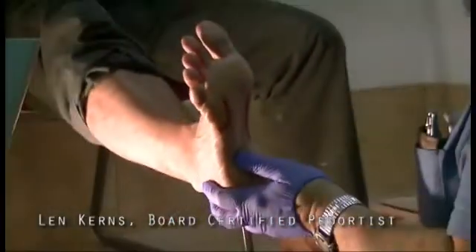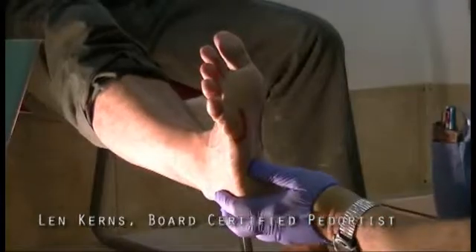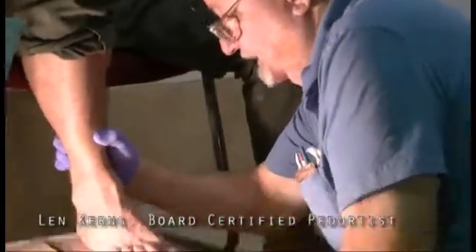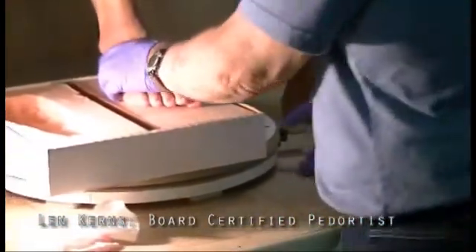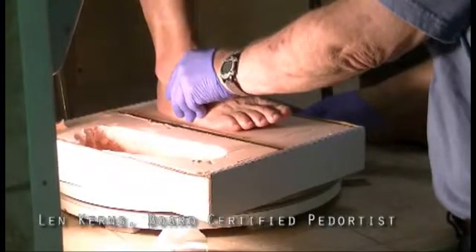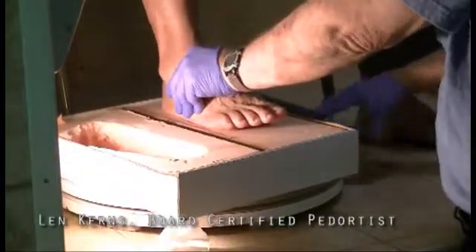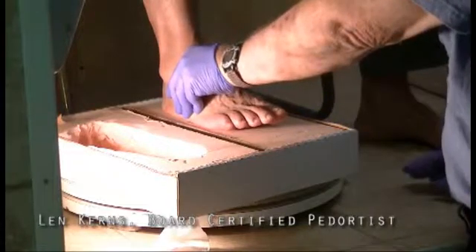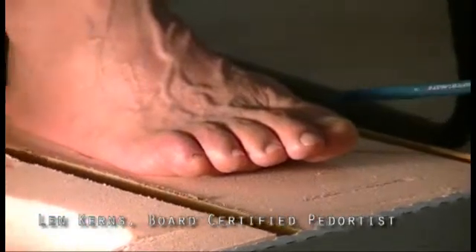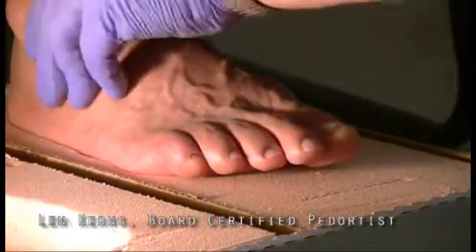And if you want to show me that the tendon is, you want a groove for the tendon, you place the foot again at 90 degrees on the box of foam. Turn it clockwise, counterclockwise. You see it's pronating. Now I'm going counterclockwise. I'm putting it subtalar neutral. And again, can you see? Now you can see there's your standard 4 degrees of forefoot varus relative to the heel being in neutral.